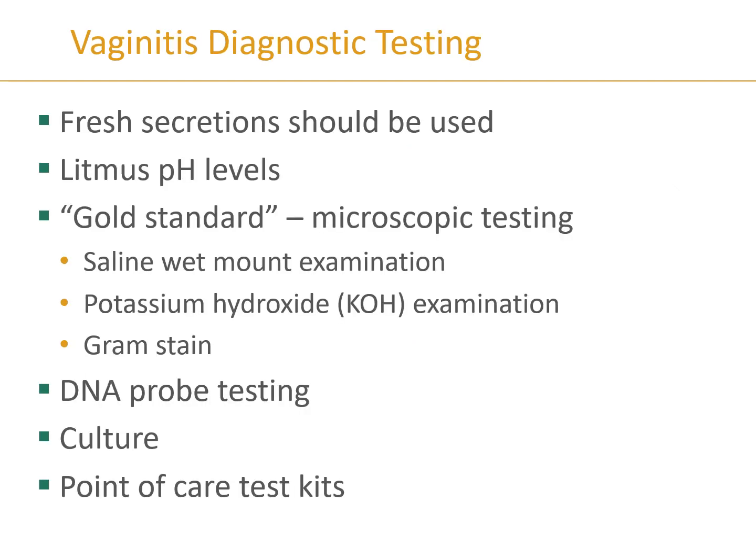When testing vaginal secretions, of course, we do want fresh secretions. You don't want specimens that have set out for a while, or were laid around somewhere on a counter, or been transported in a routine transport, so it's been riding around for a few hours. You want to test these immediately because, again, some of those organisms are very temperamental.